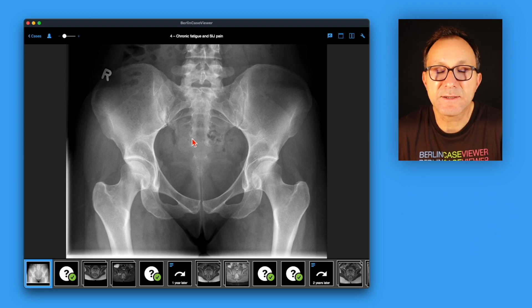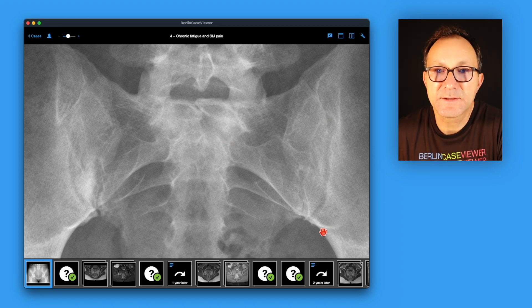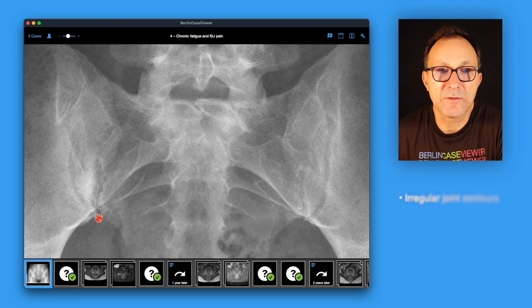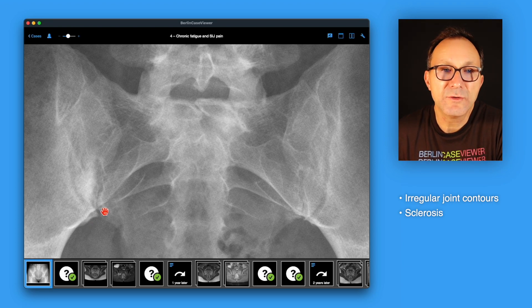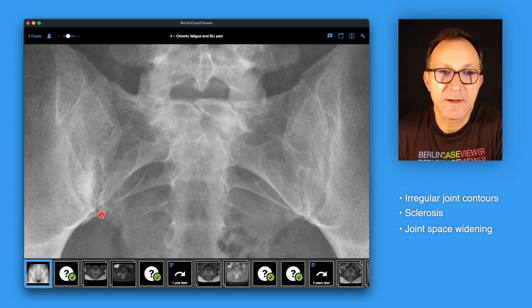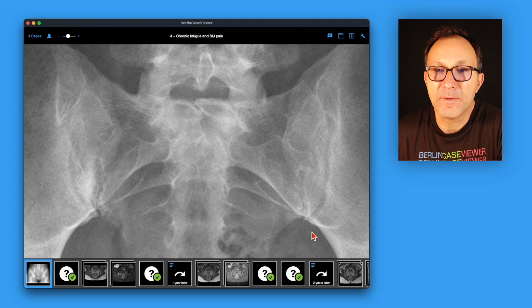Let's check this pelvic X-ray. It's in standard anterior-posterior projection and we will focus on the sacroiliac joints. Comparing the left and right sides, on the right side there is irregular contour of the joint with ill-defined margins on both the sacral and iliac sides, and there is also some sclerosis. Due to the widening of the joint, I would grade this as grade 3 according to the modified New York criteria. On the left side I don't see any clear changes, so I would grade it grade 0 or maybe grade 1.